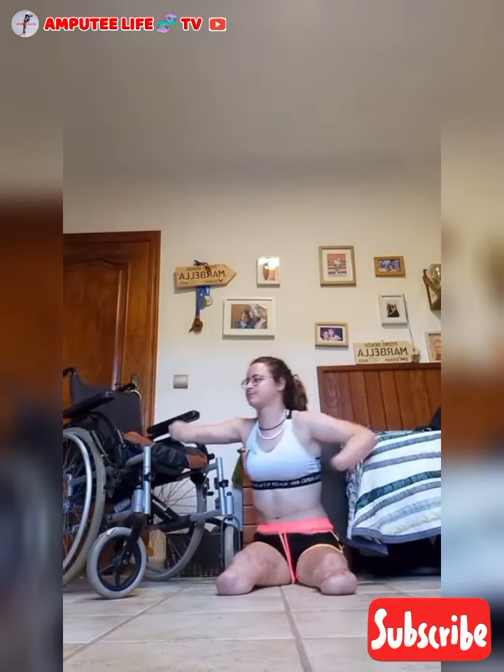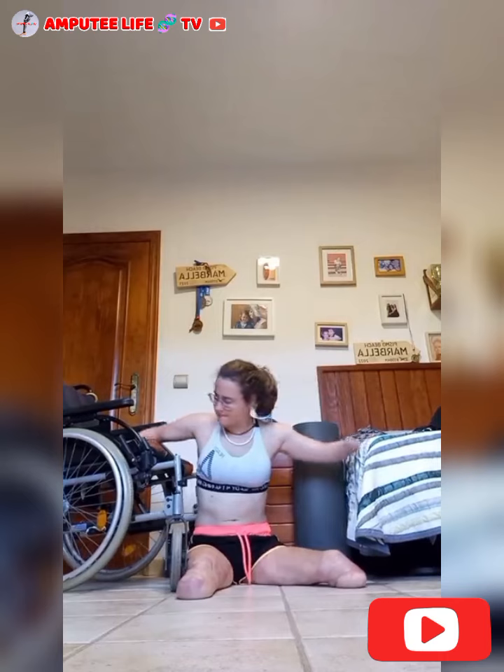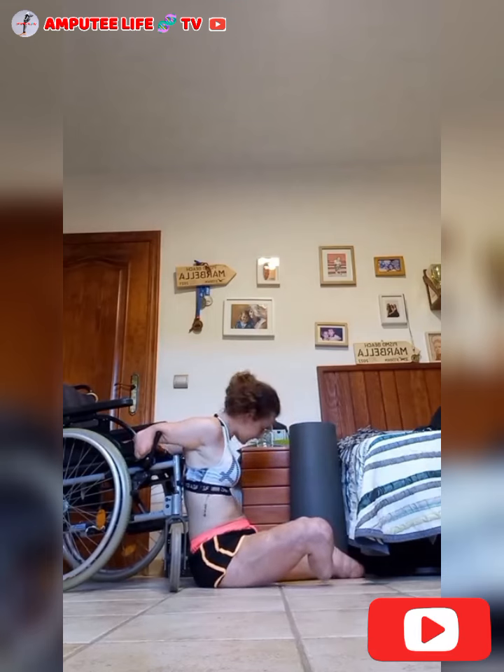Sarah is a quadruple amputee who has mastered the art of transferring from the floor to her wheelchair, a skill that showcases her strength, resilience, and independence. The process requires a combination of technique, core stability, and upper body strength, all of which she has honed through consistent practice.